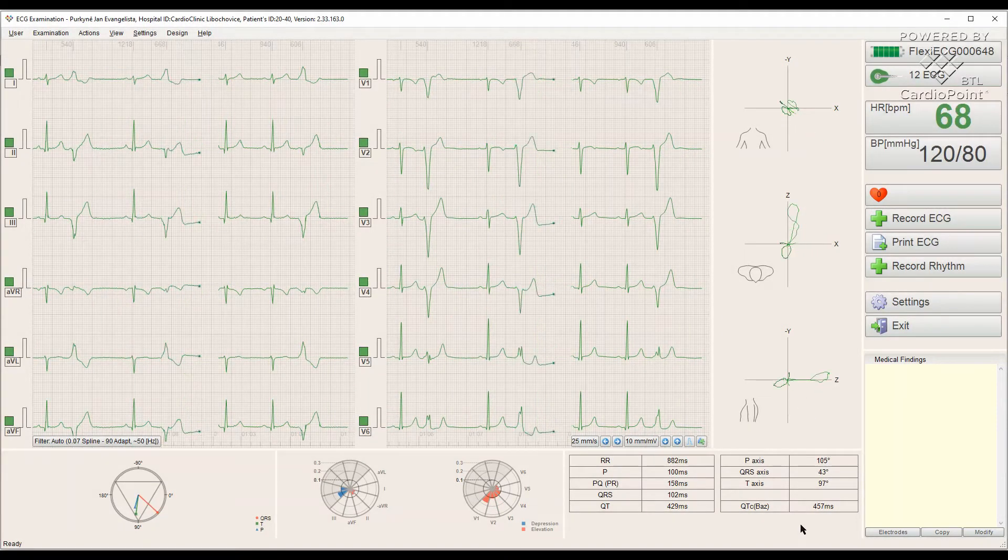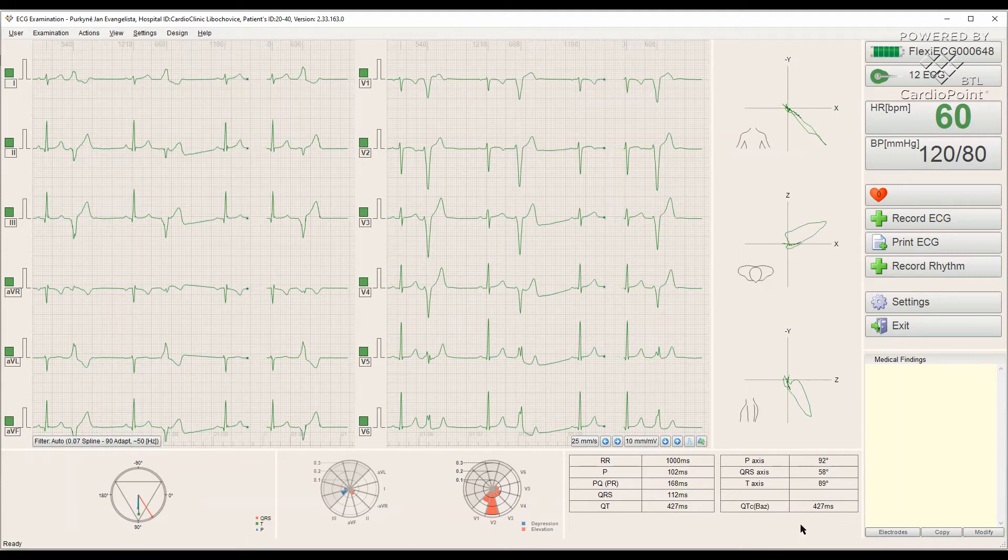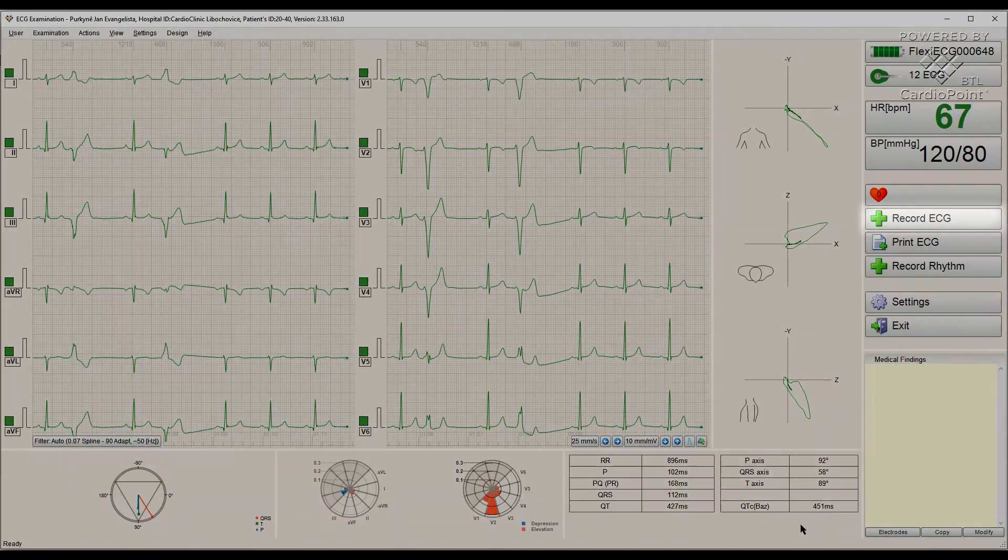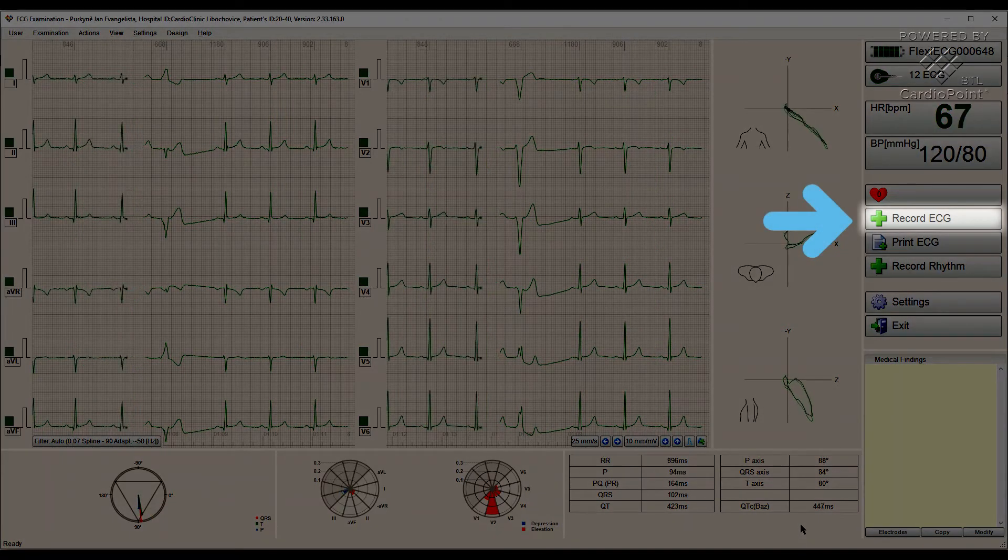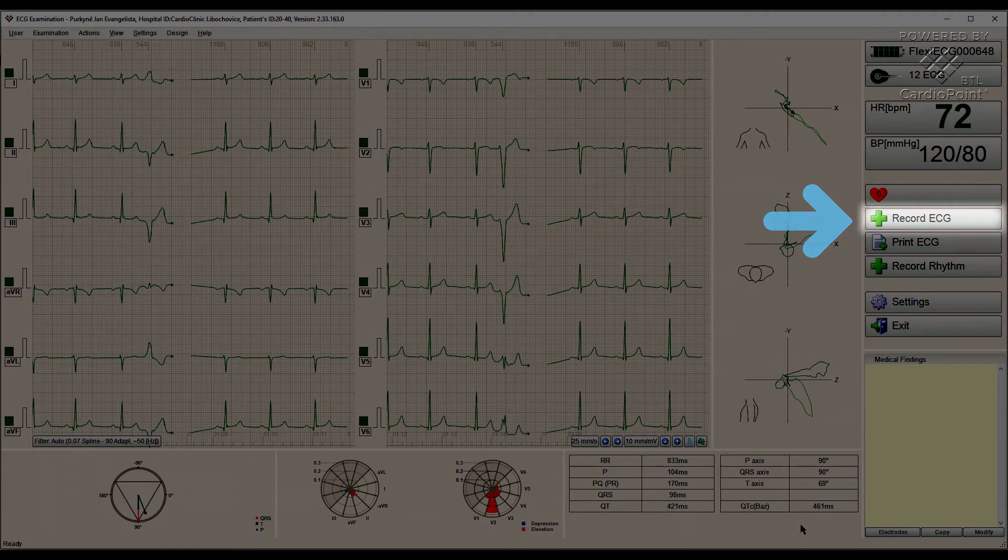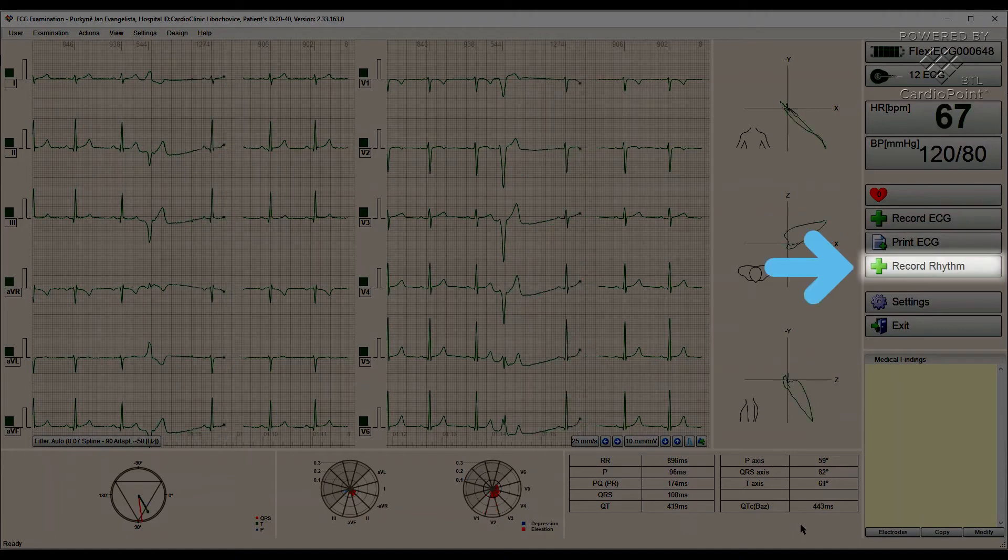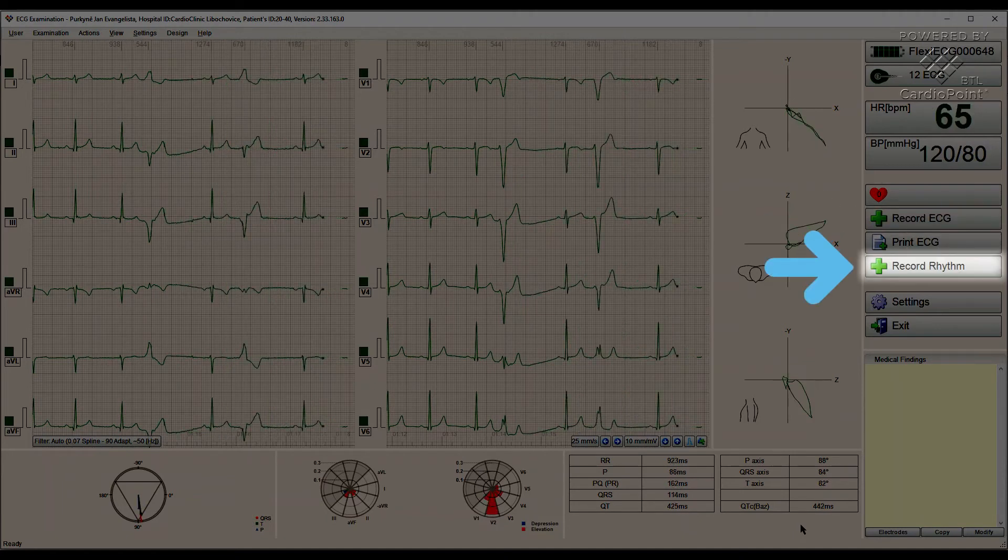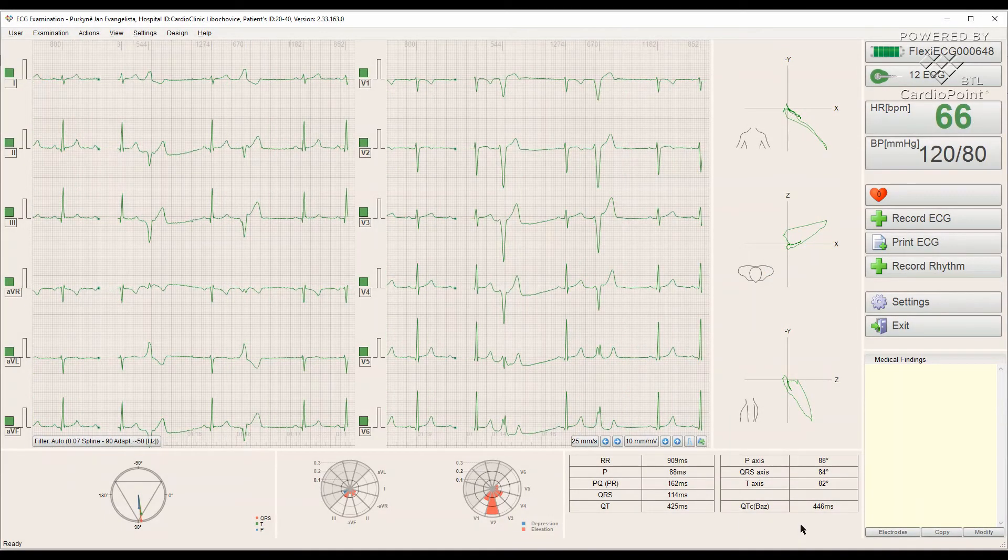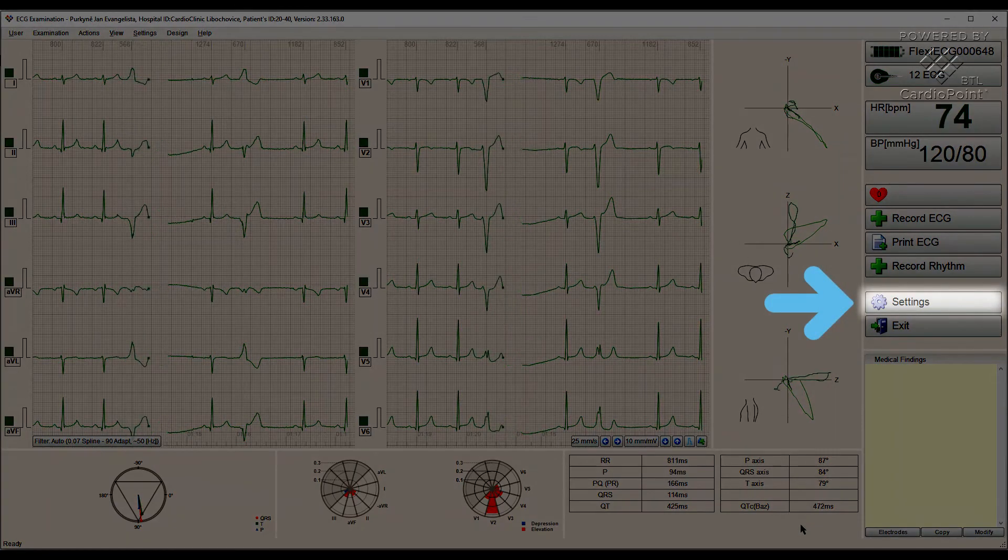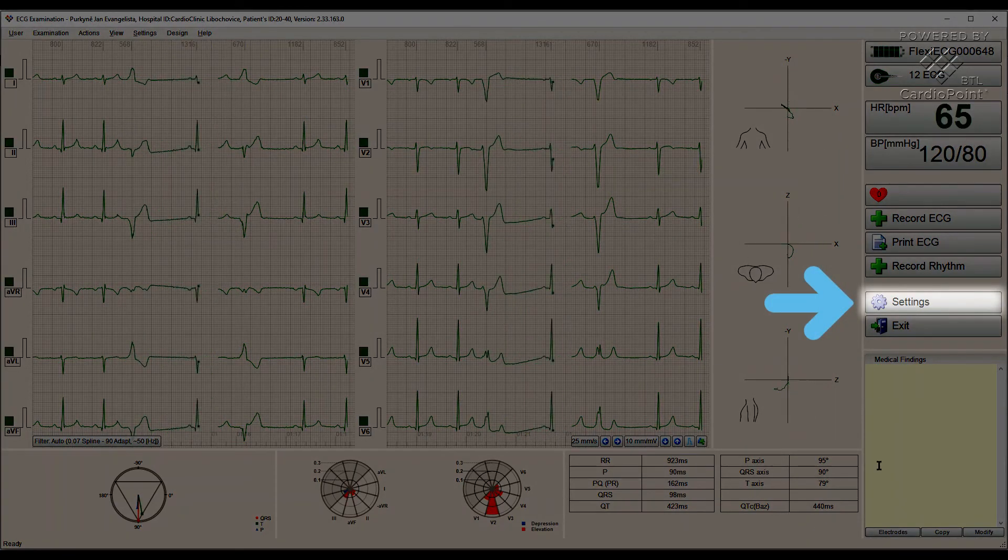To start the ECG recording, we have two main options. Record ECG signal as a standard 10 seconds ECG measurement or record rhythm. The duration of the rhythm ECG can be changed in settings if needed.